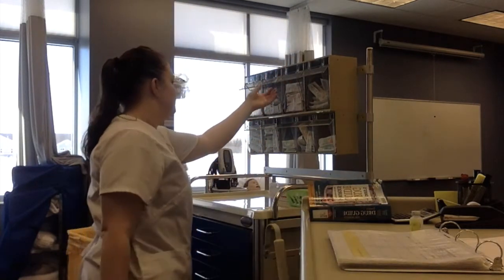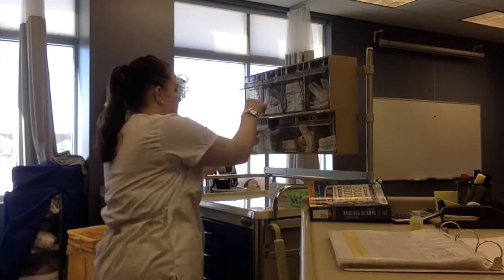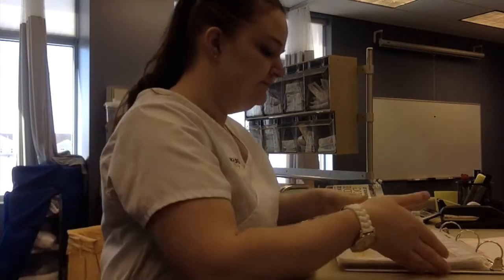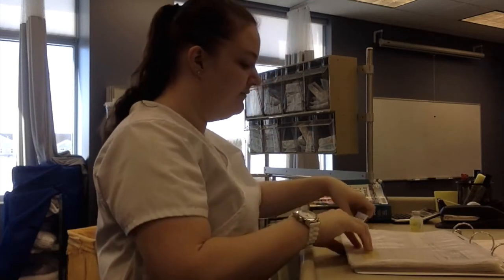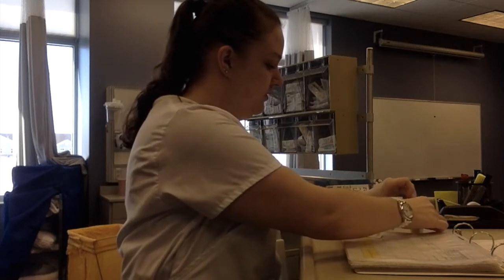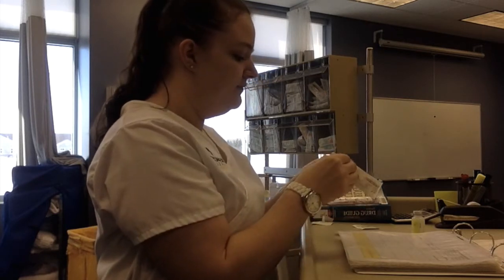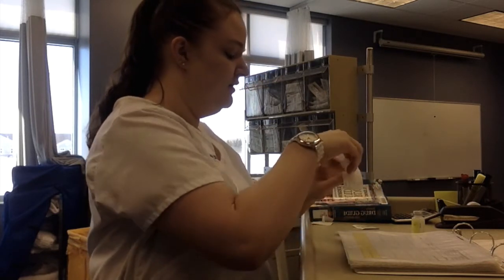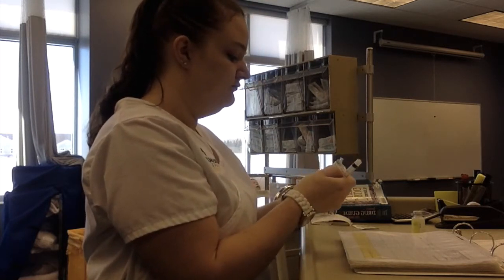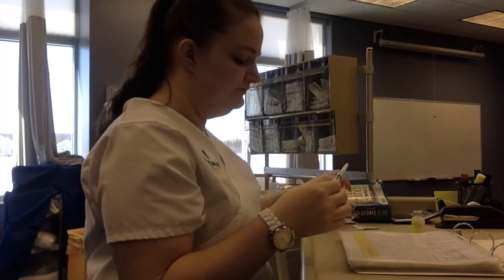I would gather a syringe and a needle. I would also gather alcohol swabs. After this, I would prepare my vial, swabbing the top and letting it dry. I would then open my syringe, keep it in a sterile fashion, and I would open my needle. I would connect the two.